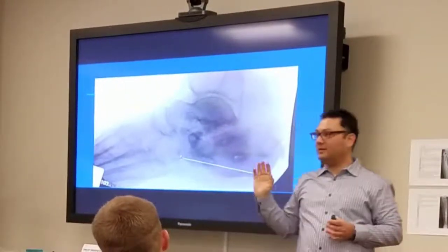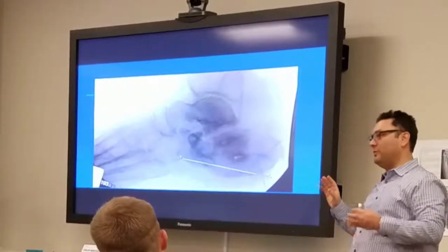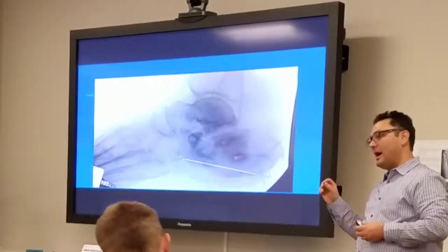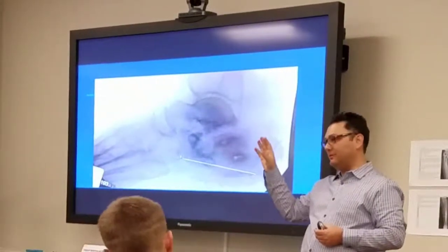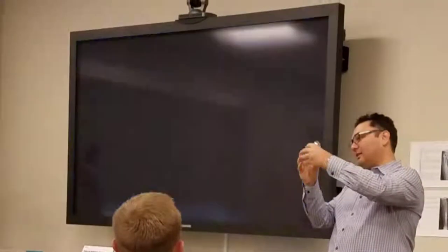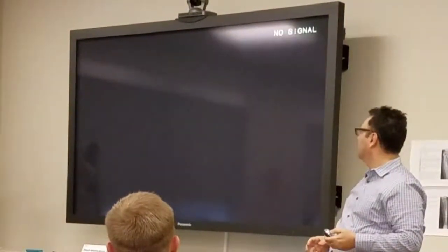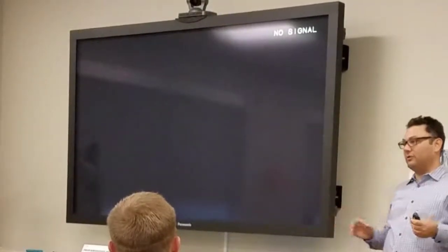Right. So, my technique. When I do this, and it seems like less people, most people like to do the open TAL, I will percutaneously nick the TAL in like four or five different spots, put on the frame, and let the Achilles stretch on itself. That's what I do. I don't like to make any real incisions over there.